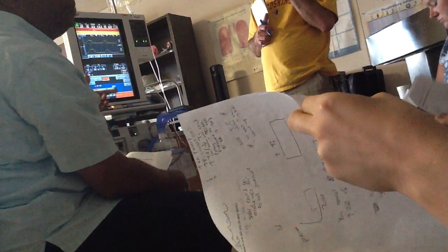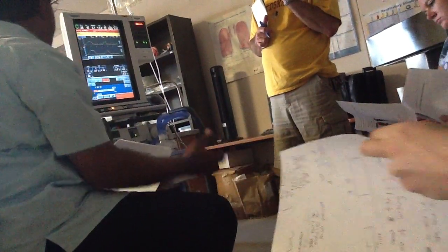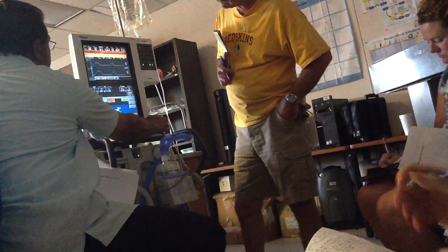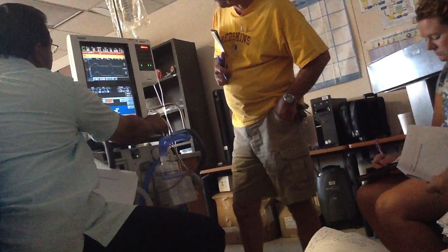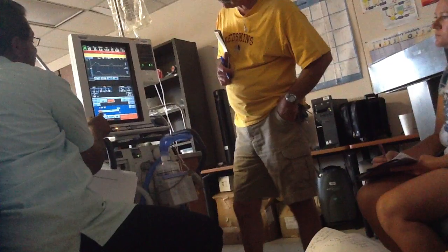Right before we changed it, we were on a 1 to 4 ratio, right? Yeah, 1 to 4 ratio before. So keep the same. How do you know it's a 1 to 4 ratio? See that TI? Push the TI and look at the bottom. It keeps changing so it goes 1 to 4. This way, decrease the TI. Once you decrease the TI, see that bottom bar says 1 to 4.